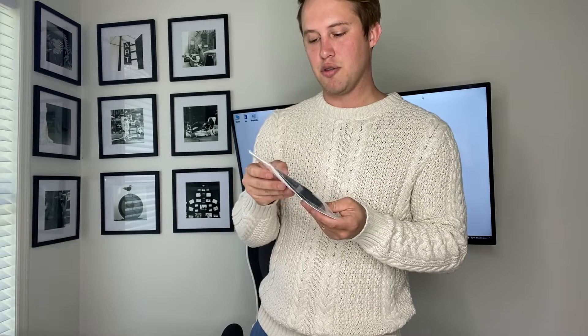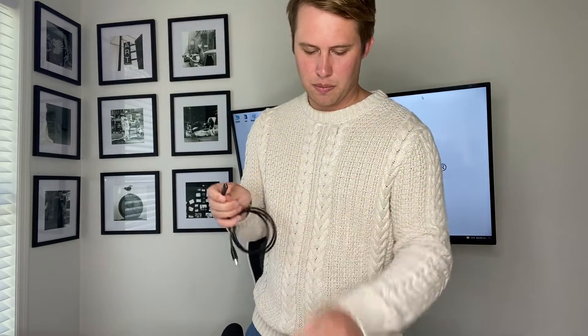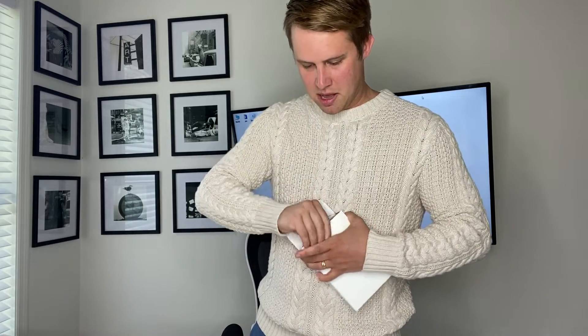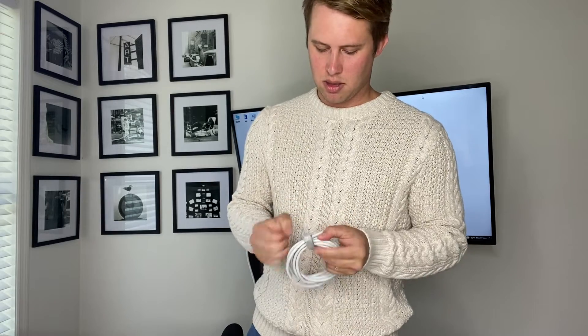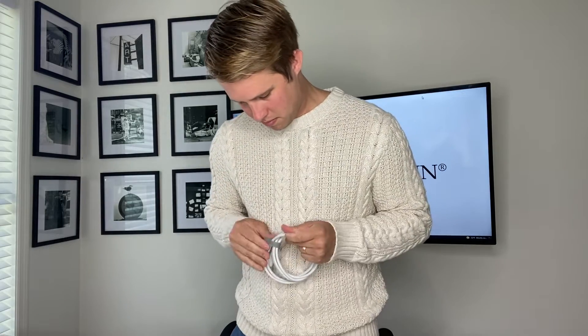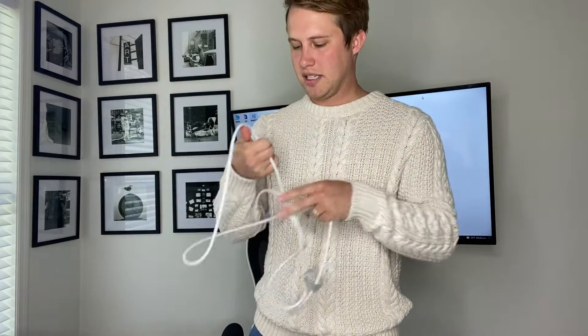This is USB-C to USB, so this will power into our jack here. And finally, our USB-C cable connects to our scanner.